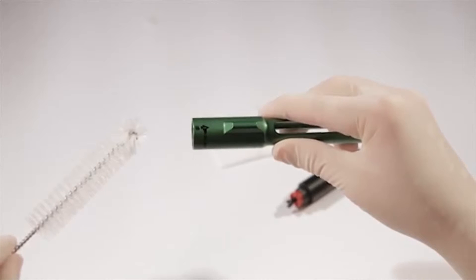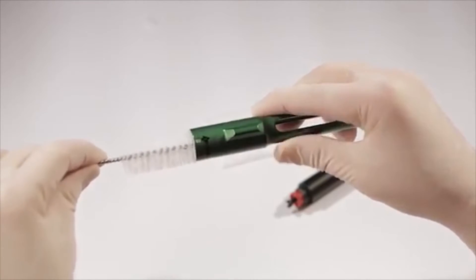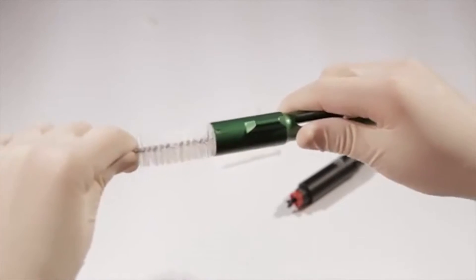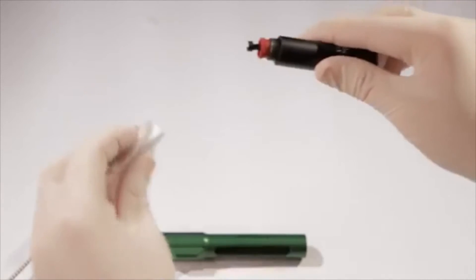The mixing pen should not be sterilized in the autoclave. Clean the inside of the pen's cartridge chamber with warm soap and water using a cleaning brush. A disinfectant wipe should be used to clean the pen body. Do not spray or immerse the pen in water or other solutions as this may cause damage.